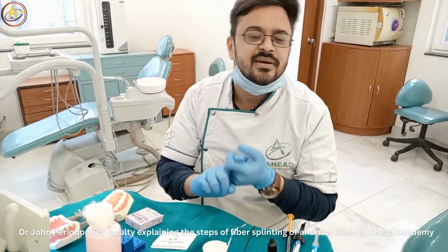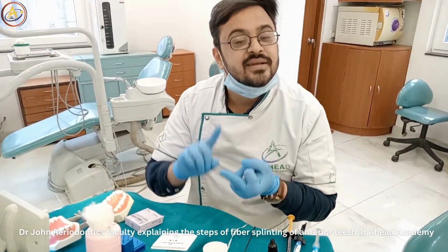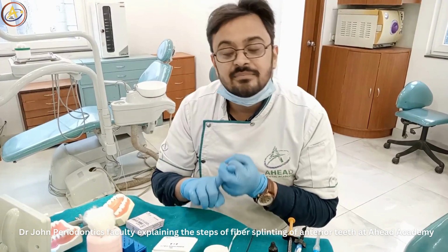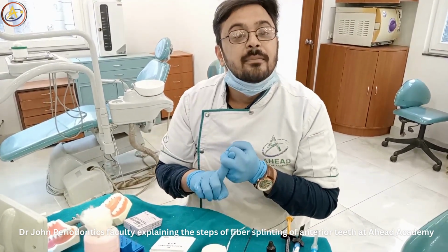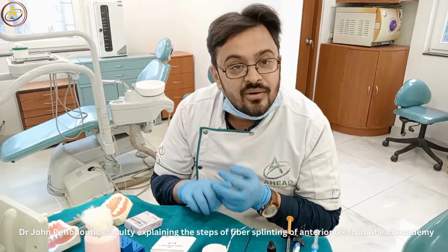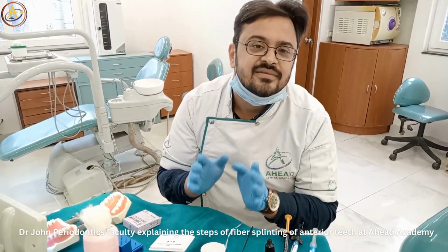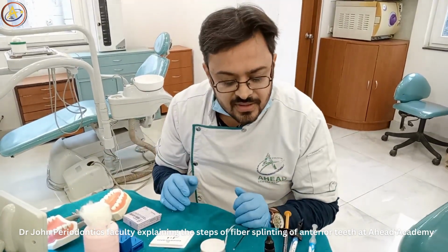So here comes your splinting. Splinting will save your teeth from extraction. Splinting will help you in aesthetics. If a patient is having a problem in the anterior teeth, some patient is having a fracture, a sudden trauma, or has had some accident, in all these cases splinting will help you in a very fast and very simple way. Okay. So today I will give you a demo of splinting.